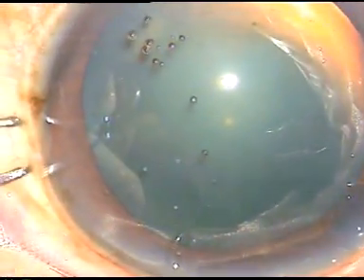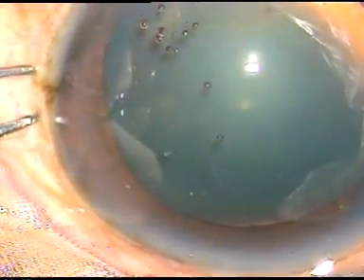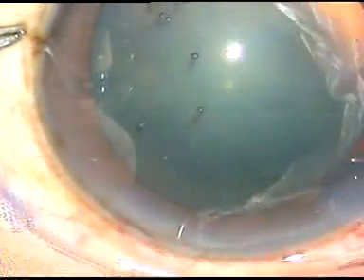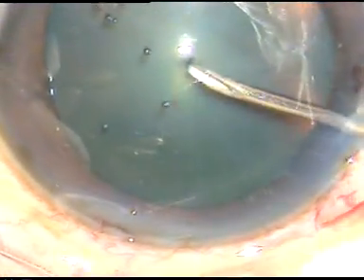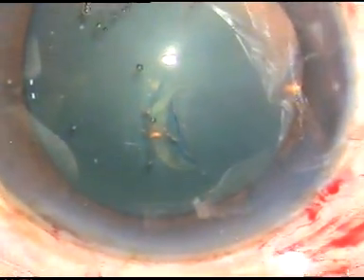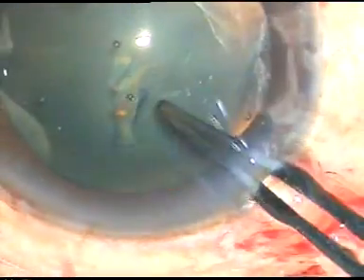This is how you can fix the eyeball with forceps very close to the limbus — hold a little bit of tissue and fix the eyeball. This is how I incise the anterior capsule to make a nice flap, which is very easy to hold with your utrata forceps. Now I hold this capsular tag with the utrata forceps.